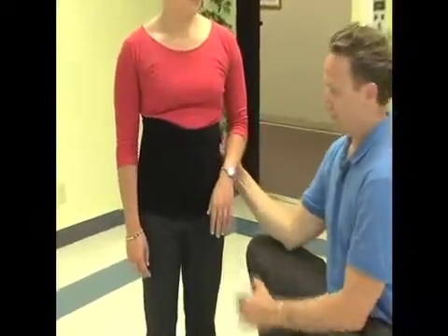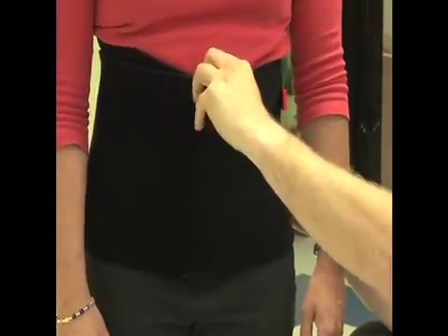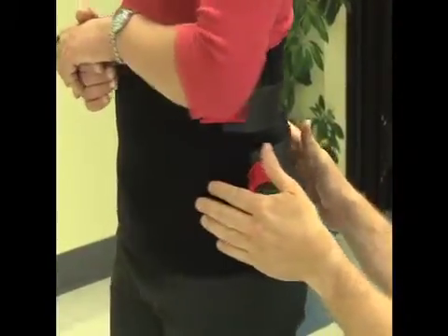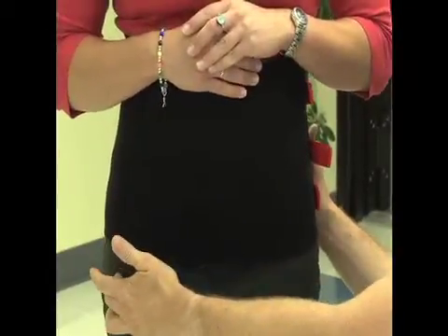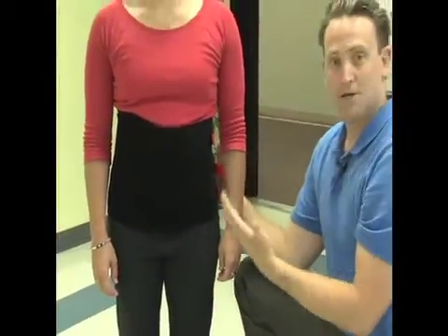To begin the application process we have the neoprene wrap. The neoprene wrap wraps around the patient's trunk to a moderate tension. It is held into place by these three straps on the side and it should be placed so the bottom of the wrap is between the ASIS and the greater trochanter. The neoprene wrap is optional — if you decide to use it, it can prevent slippage during body weight support treadmill training.